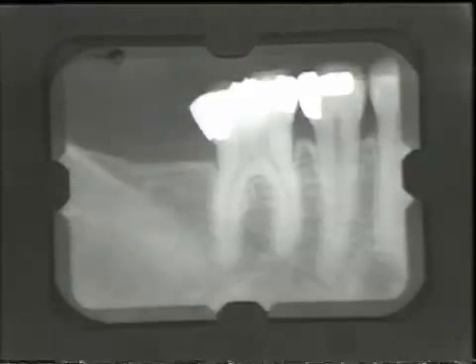Going to the abutment on the opposite side — the free-end saddle area — the bicuspid here: we're looking for any disruption of the periodontal membrane, any decay (of which there is none on this particular tooth), and perhaps a hairline fracture in the root. All are negative on this particular patient. The root form is generally very good — it's a broad root, not spindly. It has had minor bone loss, but the crown-root ratio is good. The crown is small in comparison to the area embedded in the root, and I would say this tooth has favorable support.